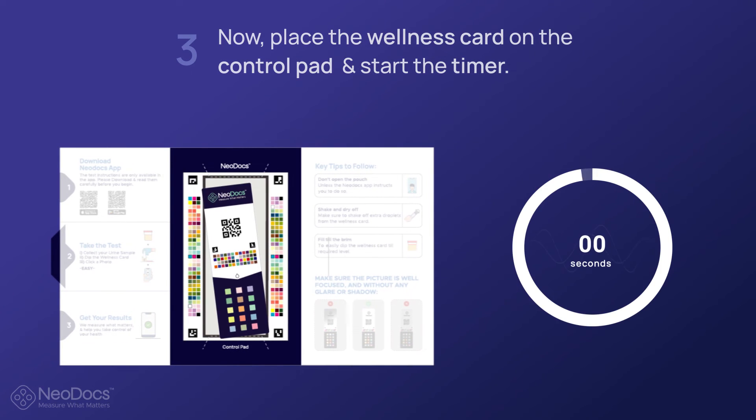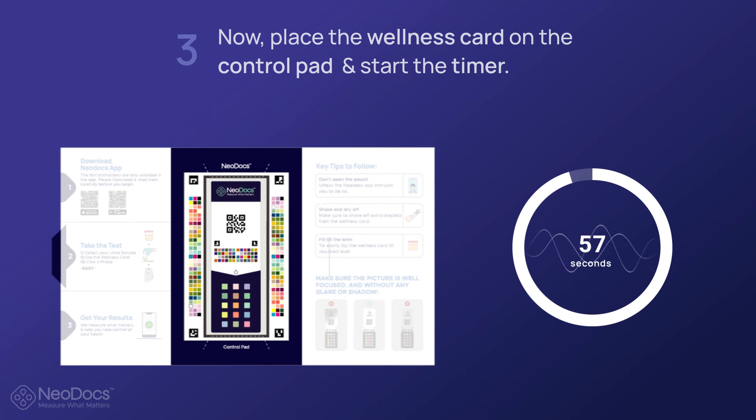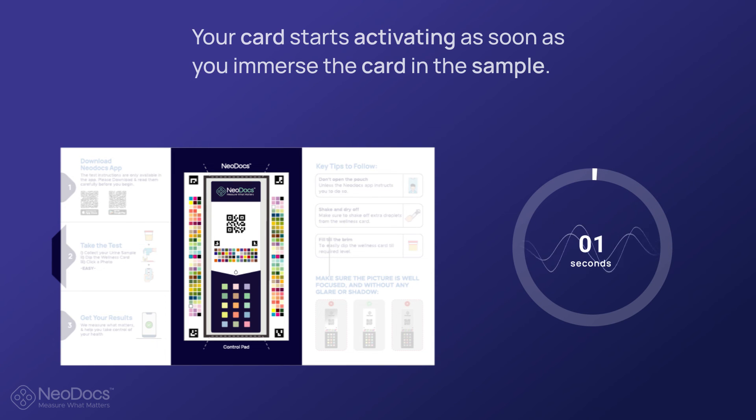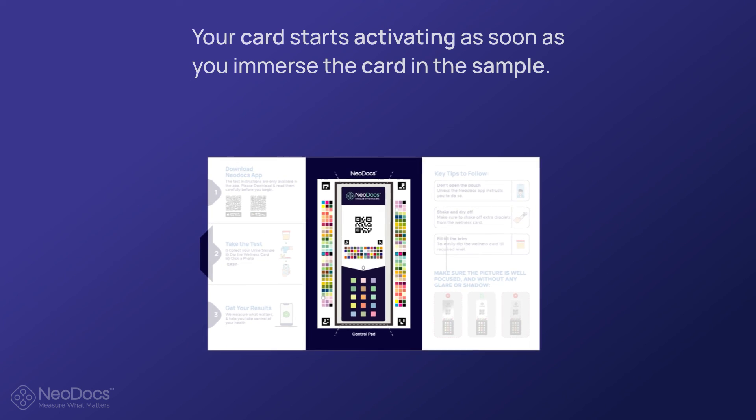Now place the wellness card on the control pad and start the timer. Make sure that the wellness card is properly aligned in accordance with the marked area of the control pad. Your card starts activating as soon as you immerse it in the sample — the 60-second timer will aid in scanning the card in the right time range for the highest accuracy.